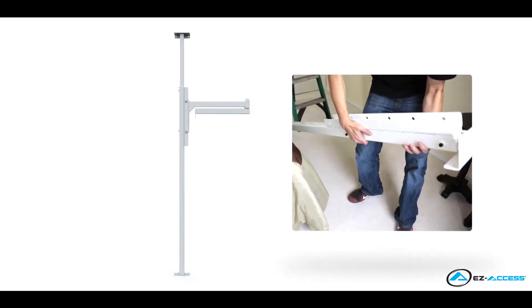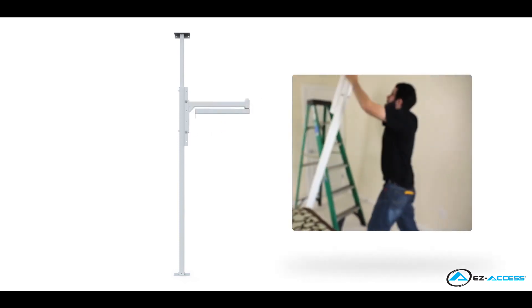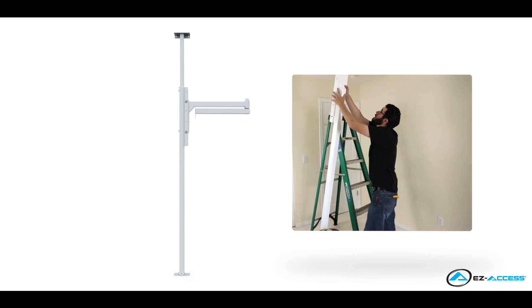The Orbit comes almost fully assembled out of the box. The arm just needs to be attached to the stanchion. The unit can then be installed and minor adjustments can be made.